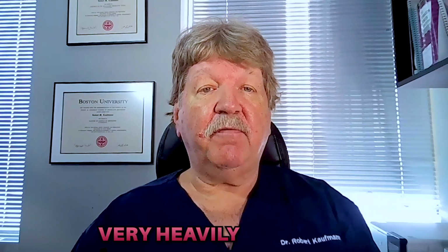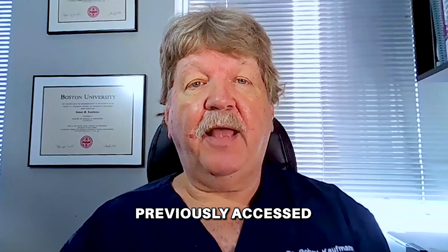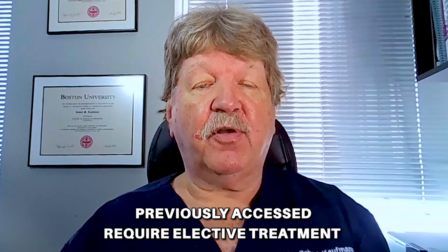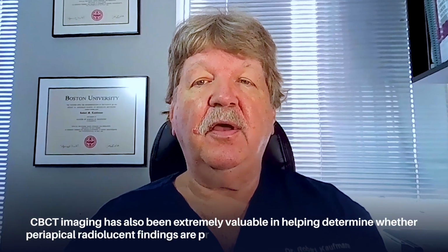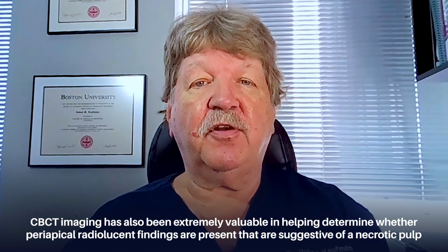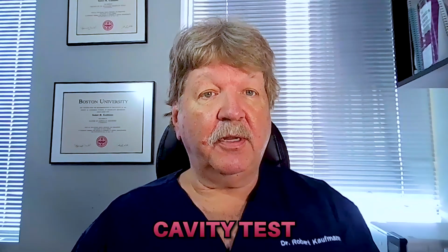I very rarely used the electric pulp test over 20 years because I find the test to be unreliable. I'm frequently treating teeth that are very heavily restored, that have been previously endodontically treated or accessed, and that require elective endodontic treatment for prosthetic reasons. CBCT imaging has also been extremely valuable in helping determine whether periapical radiolucent findings are present that are suggestive of a necrotic pulp. However, clinicians should have an EPT in their tool bag if it is required. When in doubt, I prefer to go to the cavity test, which in my opinion is far more reliable.